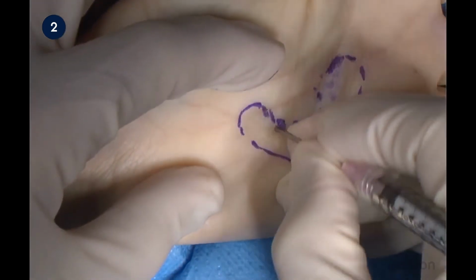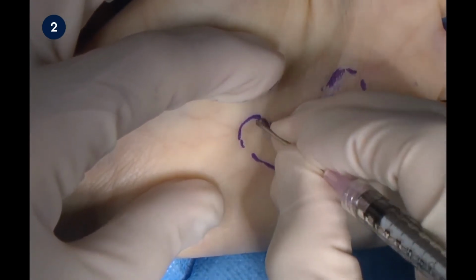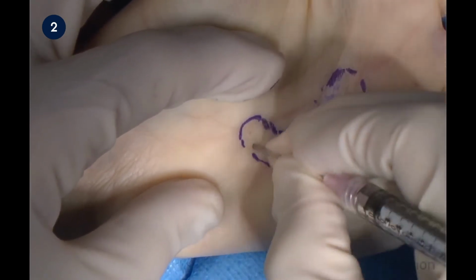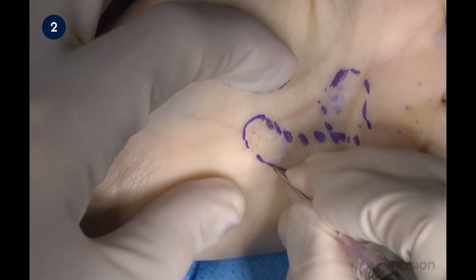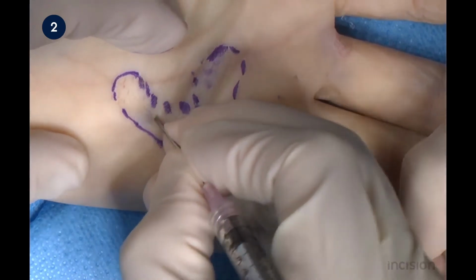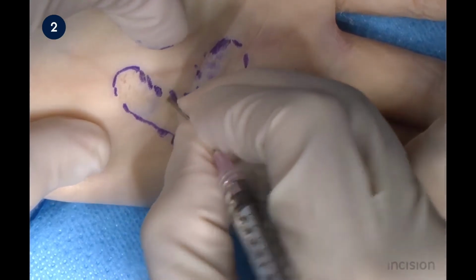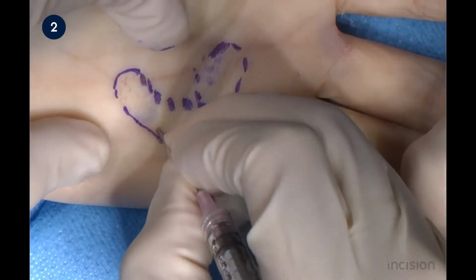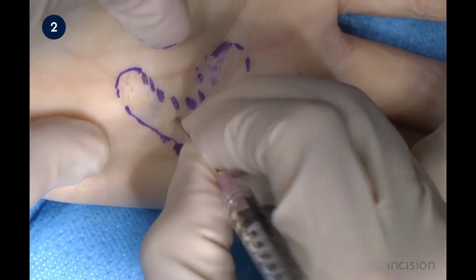Take note that the needle is placed perpendicular to the skin. A sweeping movement is used in a direction perpendicular to the pretendinous cord, hereby splitting a small part of this cord. This way, the point of the needle is used as a small scalpel. The puncture site is used as a hinge, and care is taken that only the point of the needle moves around this hinge, instead of moving the entire needle. In this film, a 20-gauge needle is used. Different surgeons may prefer different needles, but mostly in the range of 18 to 25 gauge.